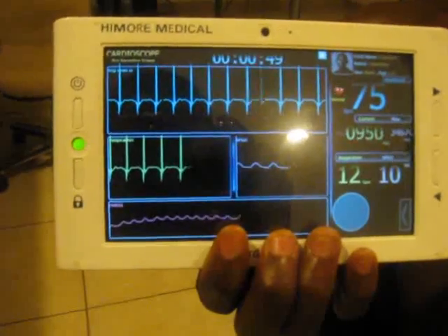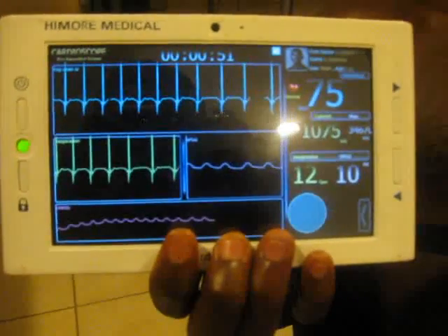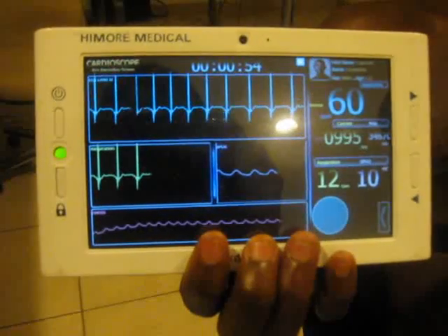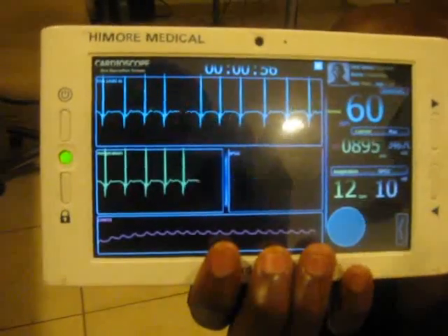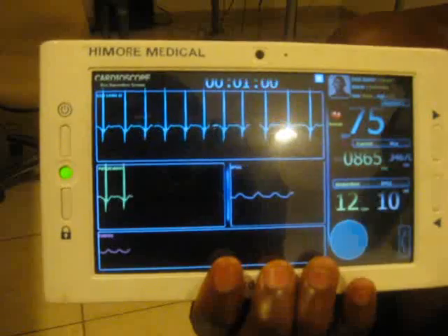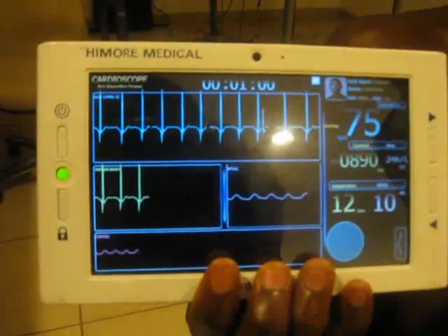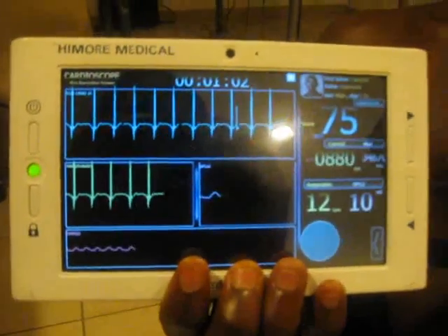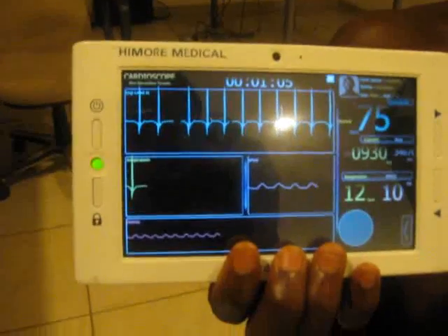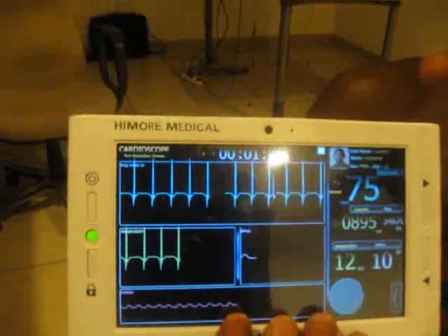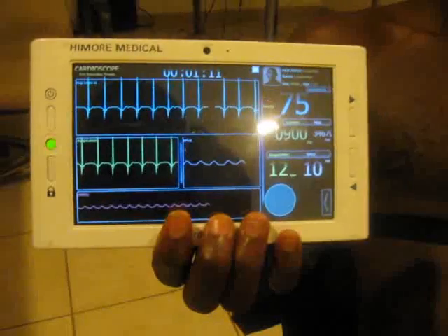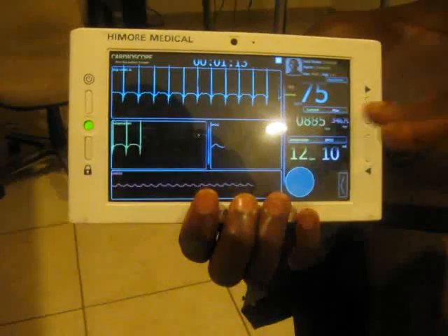On the screen of the Pad ECG Scope, you can see the heart frequency, which is computed in real time. We also have some indication about the bradycardia, the tachycardia, and the different events which occur during the heart examination, as well as the different leads of the ECG signal, the respirations, and the R-R interval.